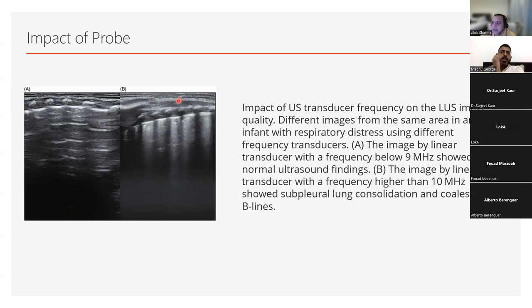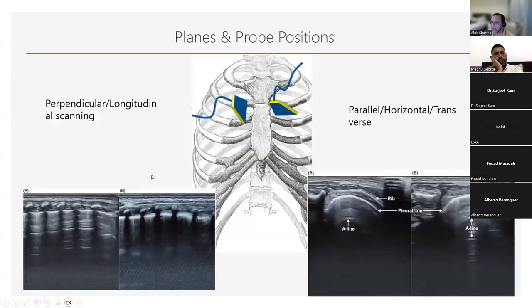Right. Okay. So just to carry on. How do we scan? There are two kinds of scans. We're going to use standard terminology over here. I'm going to go through nomenclature. Abhijit will cover it next Sunday. I will also cover some of it on Thursday. But really, from my perspective, what is really important is we're going to use the terminology perpendicular and parallel. It's just easy to remember.